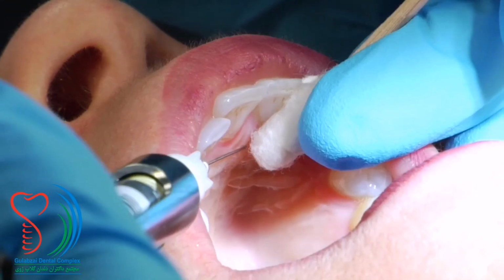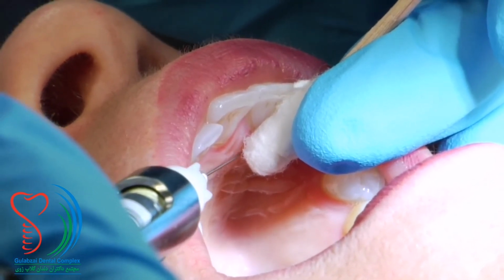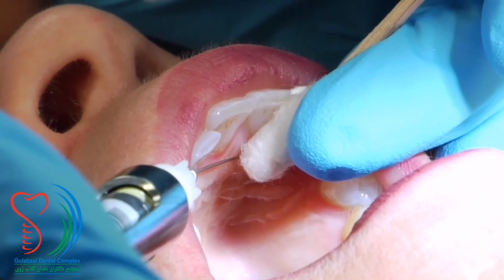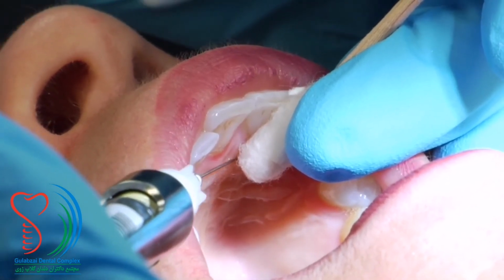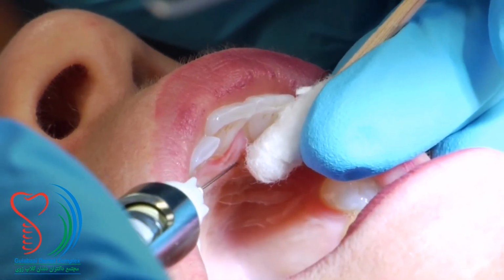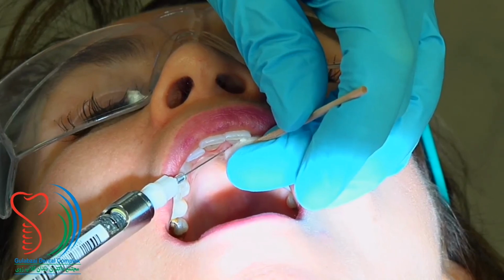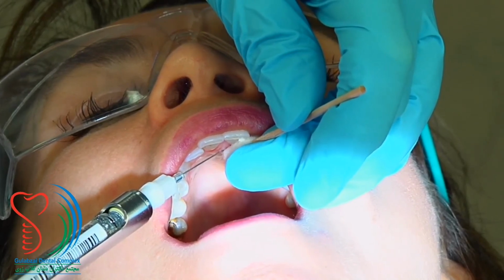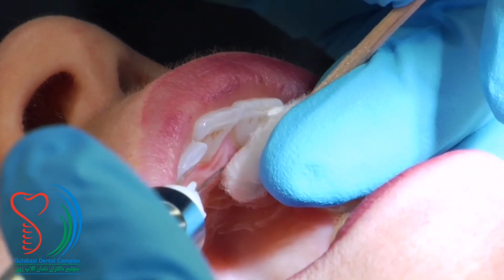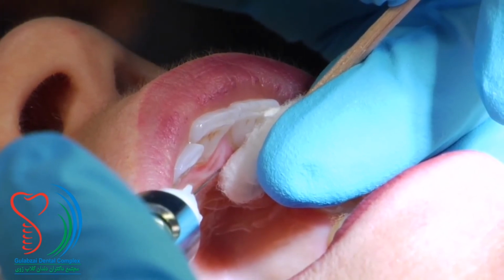Do not allow the needle to penetrate the tissue yet, holding a positive pressure on here so you're dispensing a drop or two at a time over several seconds. Then slowly letting the needle slide into the tissue until you've met resistance at a depth of about 1/4 of an inch. After negative aspiration, very slowly deposit 1/4 of a carpule or less with aspirations.